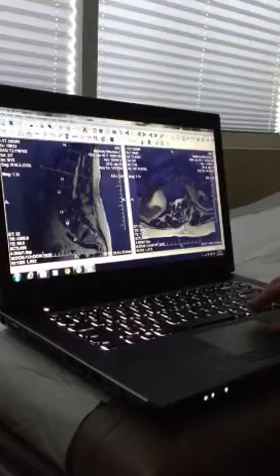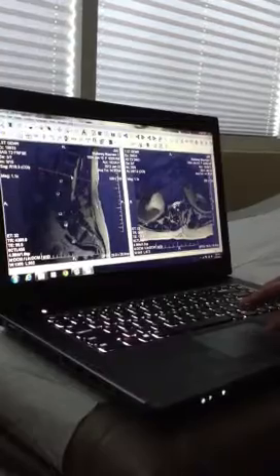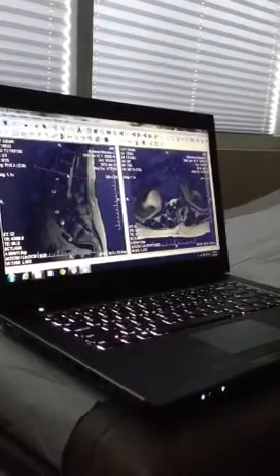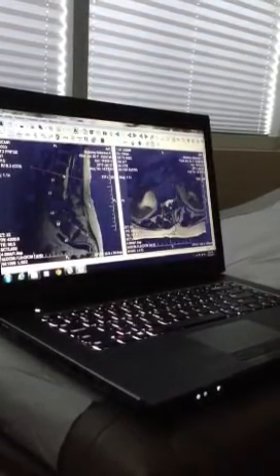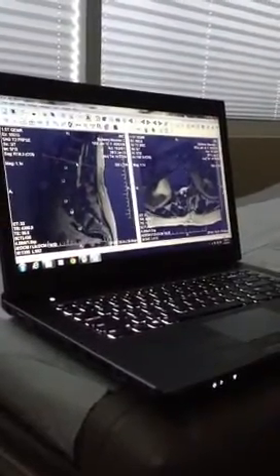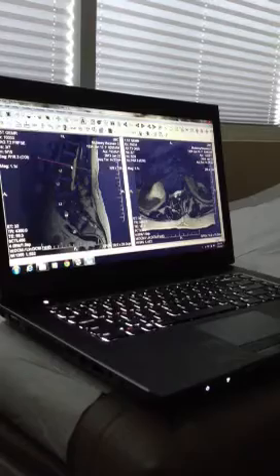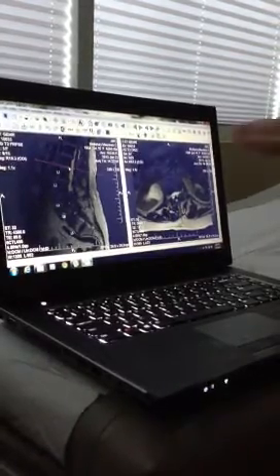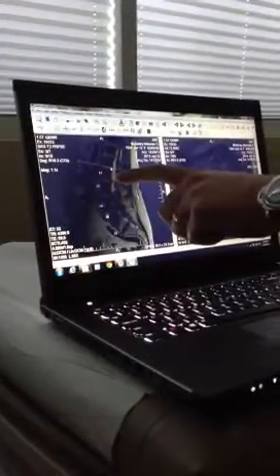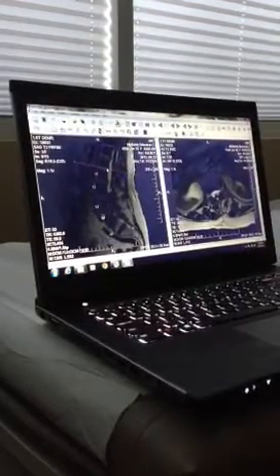When we look at the discs, we want to see a healthy disc. Now, I'm going to tell you that your discs are what are called desiccated, so they're a little bit dried out. One of the reasons for that is, as we age, we lose a protein called proteoglycan. Proteoglycan is hydrophilic, it attracts water. Think of the disc as a wet sponge. A healthy normal disc is going to be compressed and then re-expand, compressed and re-expand. Remember we talked about on T2 weighted images, water is white. Your discs are dark, so that shows us that the discs are somewhat desiccated.